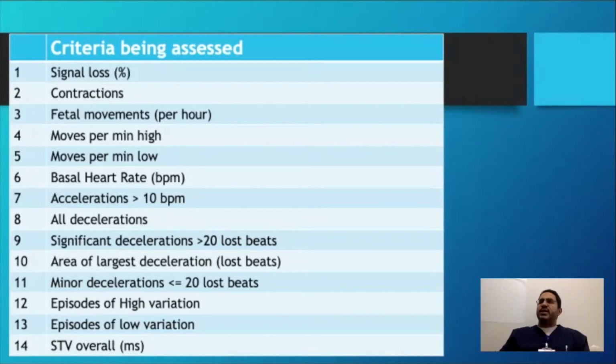And that's where I'm saying it tries to look at accelerations and activity when it perceives that the baby is awake. However, that has no implications on whether it's meeting criteria or not. So the fact that it's completely flat and not moving, okay, and then it has what it perceives as a movement, or the woman perceives as a movement, the fact that it just happened in a high variation is a happy thing. Whether it's a true movement or not, it's not going to be as accurate.